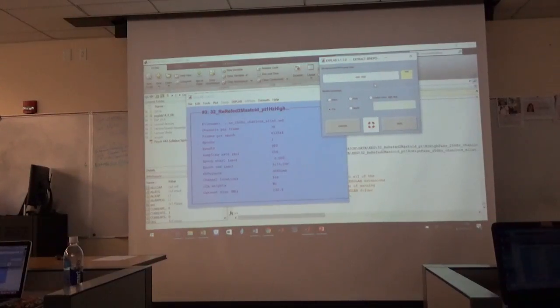I have a question. What's the life buoy button? What is that supposed to be? That's for settings, I think, or help, maybe. But you don't have to worry about that right now.